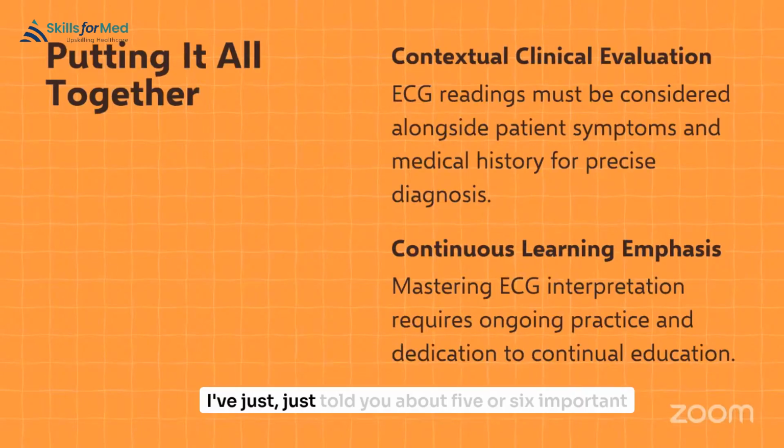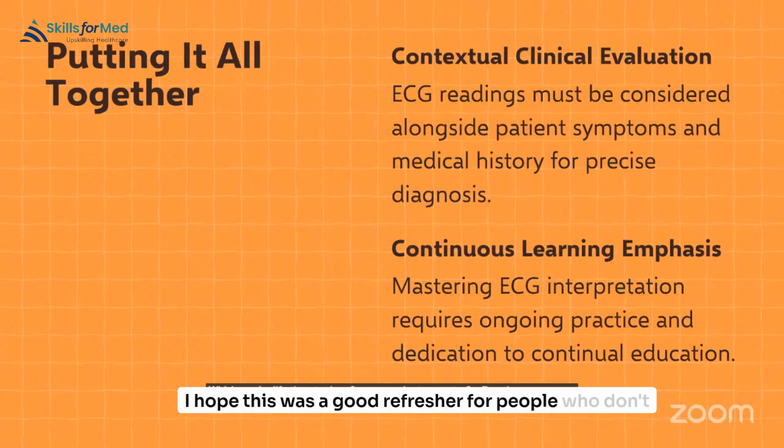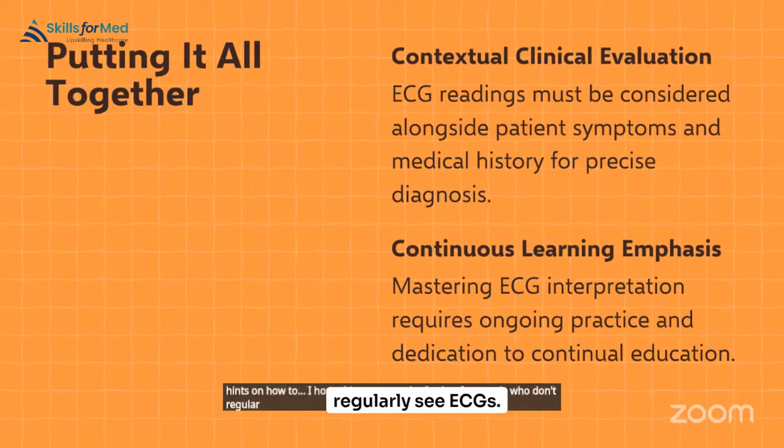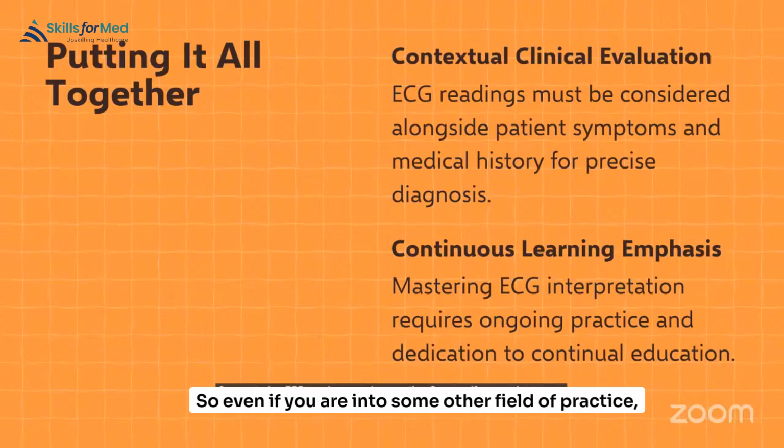I've just told you about 5 or 6 important ECGs which can be life-threatening. So every minute counts. I hope this was a good refresher for people who don't regularly see ECGs. So mastering ECG requires ongoing practice. Even if you are in some other field of practice, whenever you see any patient who has an ECG in the file, take the ECG, look at it, and try to interpret.